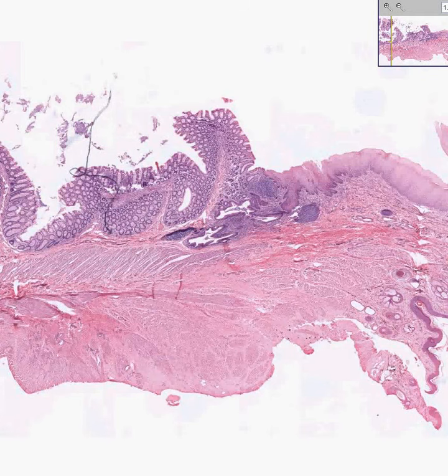There are several areas in the body where we have a transition in surface epithelium from a columnar or single cell type of mucosa into a multi-layered or stratified squamous type of mucosa. And the anorectal junction is one of them. I could probably think of a couple more, like the gastroesophageal junction, as well as the squamocolumnar junction of the cervix, where the ectocervix changes into the endocervix.